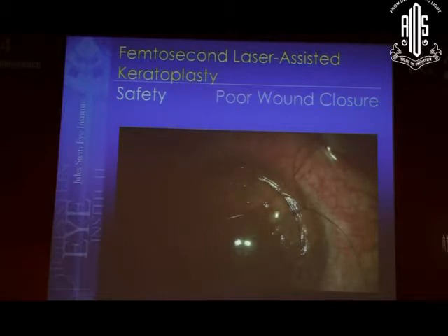And I think what happened here, this is the edge of the donor cornea. Here's the edge of the host, and this is the anterior side cut. So this should be here, but it's not. There's a big gap here. I have the radial alignment marks to confirm I did not misalign the tissue. I think there was such a distortion of the donor cornea, though, during the trepanation, that it just resulted in a very poor quality match. So I've now learned I really don't consider femtokeratoplasty for very, very steep corneas.